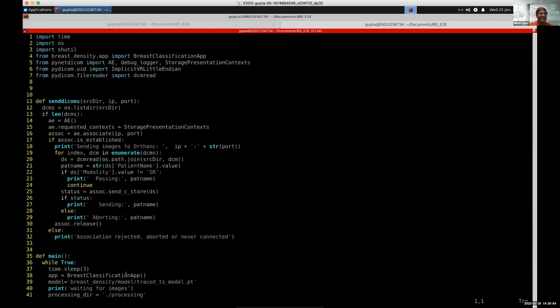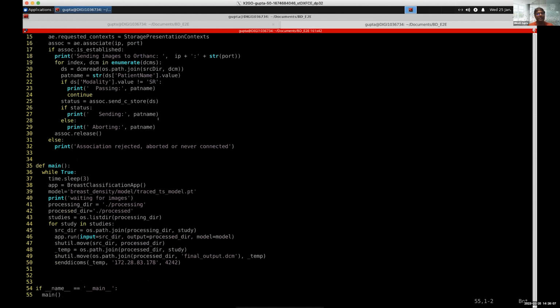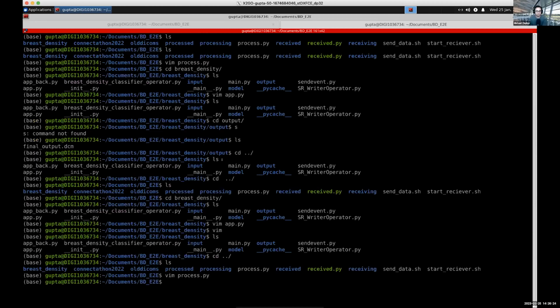There are these watchdog kind of Python libraries, and you can just string them together. So this was such a specific use case that we didn't put it into this thing. Yeah. And reach out to me if you have questions. I can reply to you directly. No problem. Okay. Yeah. Cool.